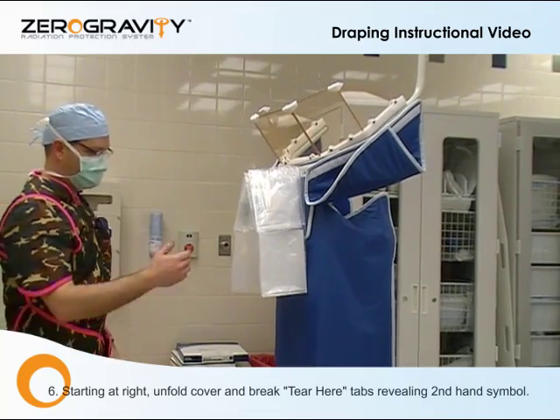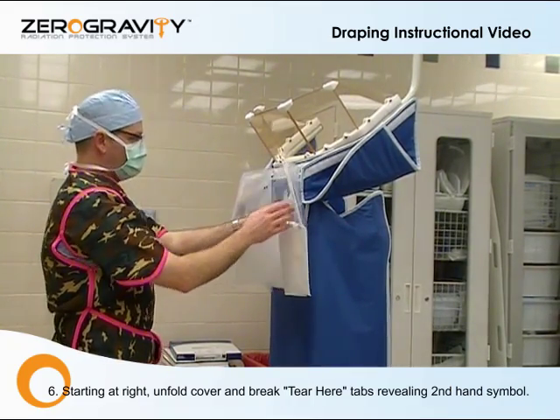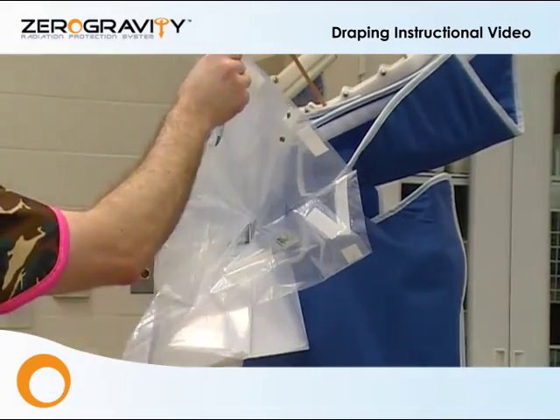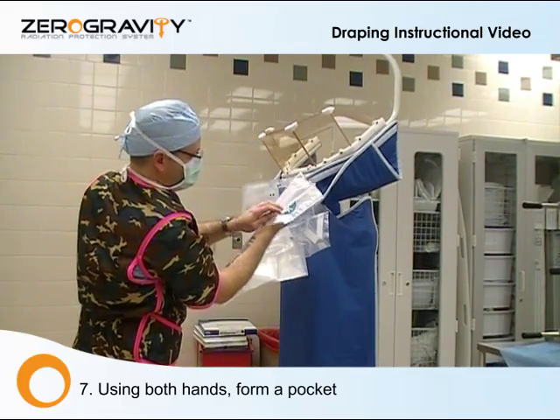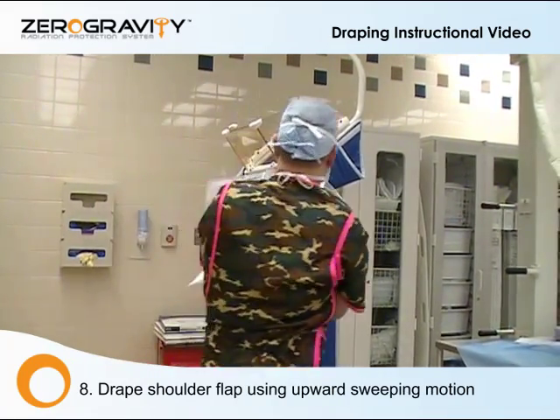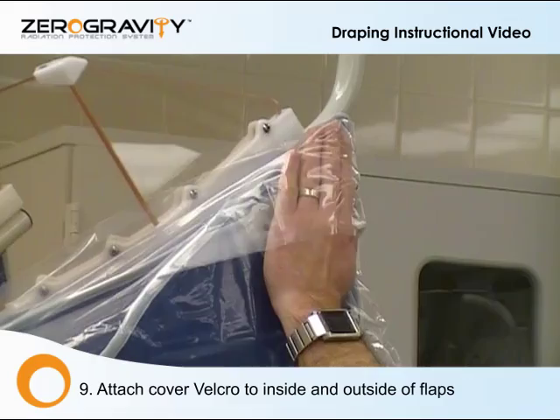Always start to your right. Remove the tear here. Pull out and unfold the arm pocket. Insert hands where labels indicate. Separate. Now there's a downwards and upwards sweeping motion — I'm going down and up.